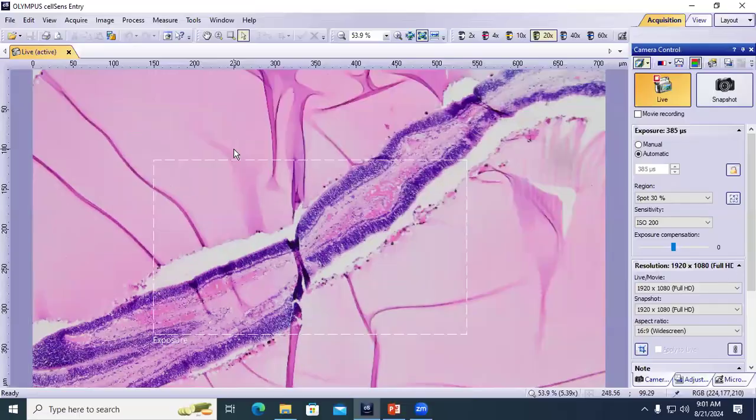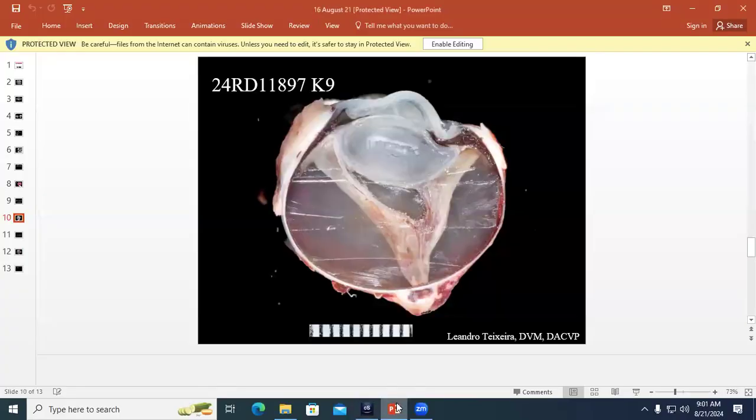The main causes of it in dogs are systemic tumors, especially multiple myelomas or some B-cell lymphomas, but there are also some infectious processes that can cause specifically gammopathies that can cause hyperviscosity syndrome. They were already suspecting hypertensive retinopathy, and the vessels that we've seen do look thicker, but hypertensive retinopathy or chorioretinopathy does not explain that exudation. So it's more likely that something systemic, like a tumor.